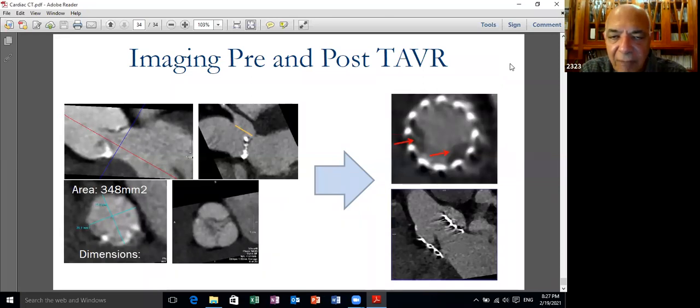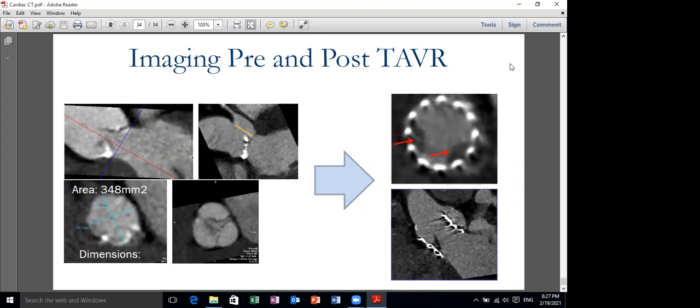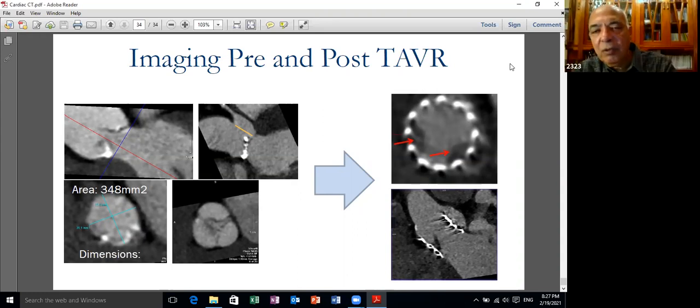Many of these patients have chest pain, so most of them don't fall into the category of low and intermediate risk because of their age and the calcification of the valve. So usually you need an invasive arteriography. We don't use it as a routine in these patients. You cannot use it at the same time as a replacement because you are giving almost 100 cc of dye. If you don't get solid information, you are going to repeat the procedure by invasive angiography, so that's a double dose of dye.